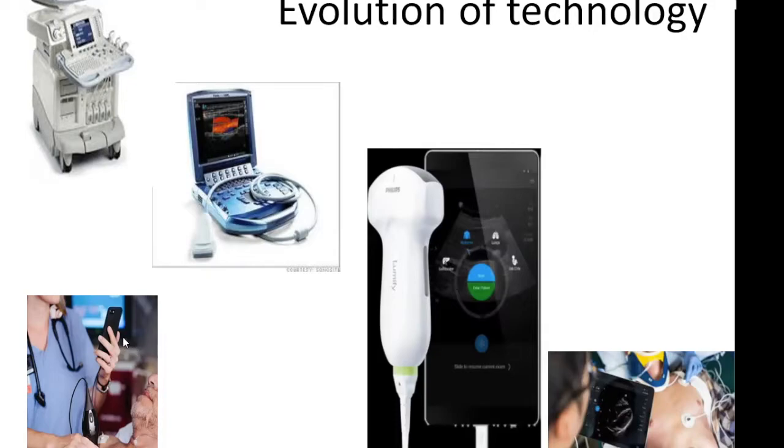And this is the Butterfly, the latest iPhone-based imaging with ultrasound, which I have one here and attaches to my iPhone. And in fact, I will talk about a case I went up to ITU yesterday to see, and using the iPhone made a diagnosis.